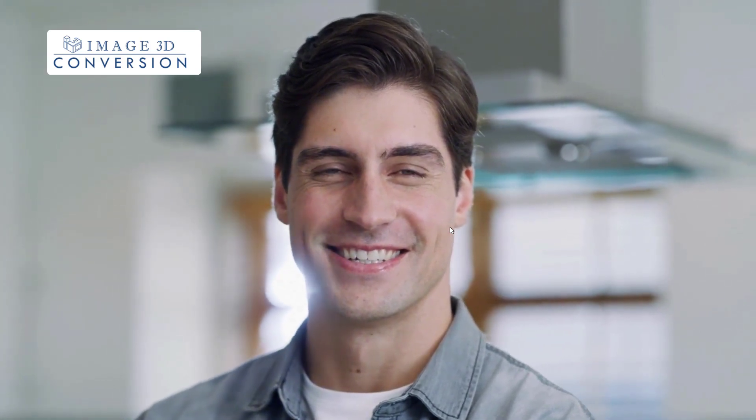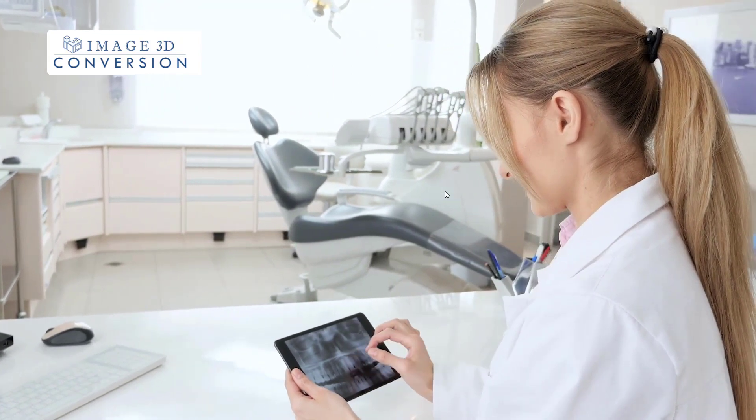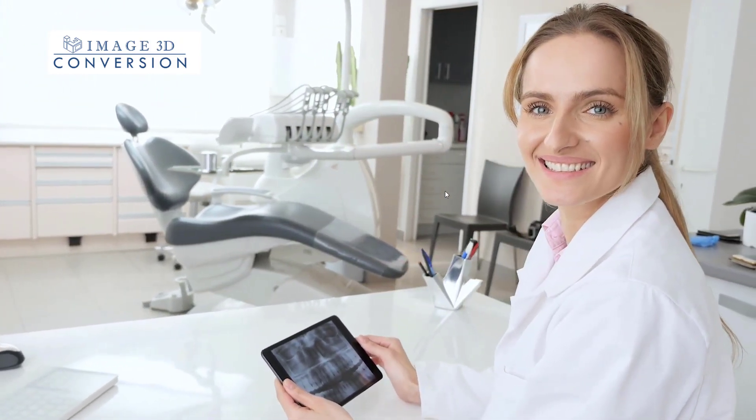We're proud to work with dentists to help their patients achieve the beautiful, healthy smiles they deserve. Join the many satisfied dental practices who have benefited from Image 3D Conversion's All-On-X surgical guides.